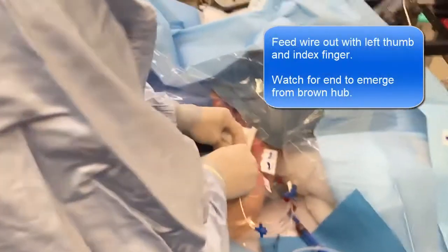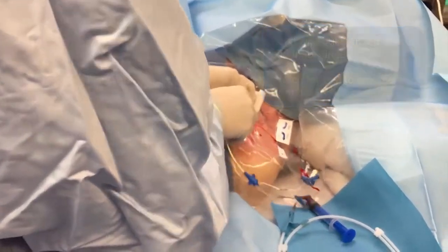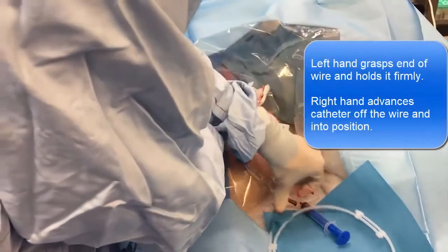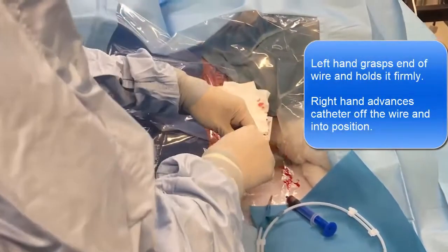So the risk of a pneumothorax is no, because I never pointed down towards the lung. And when you start scanning, you'll see that the lung is actually a long way away.